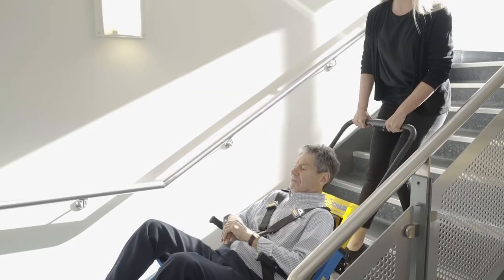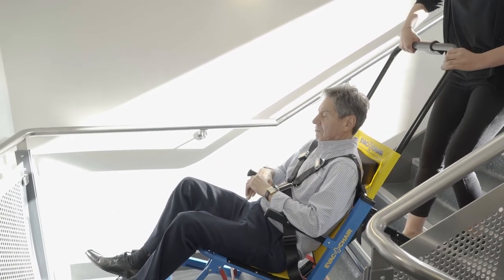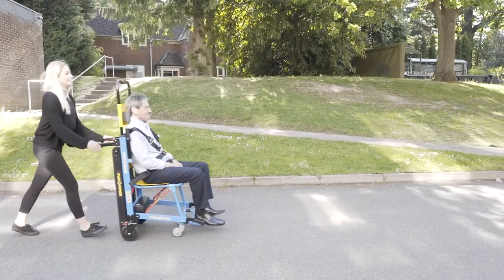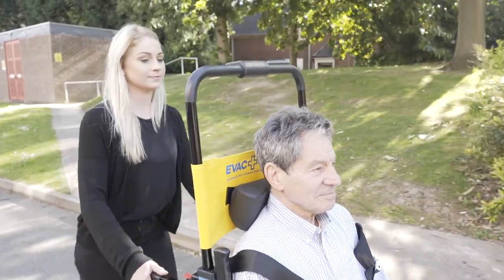At the bottom of the stairs, simply tilt the chair forward using your foot as a counterbalance if needed, in a controlled manner, to continue horizontal travel. Once the final destination has been reached, the safety belt can be released and the passenger can exit the chair.